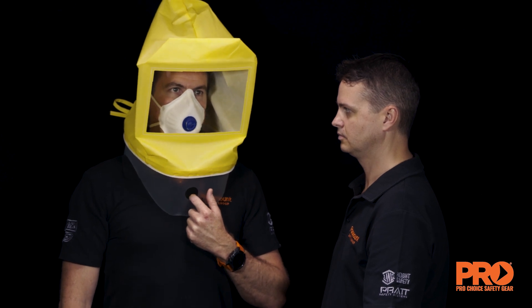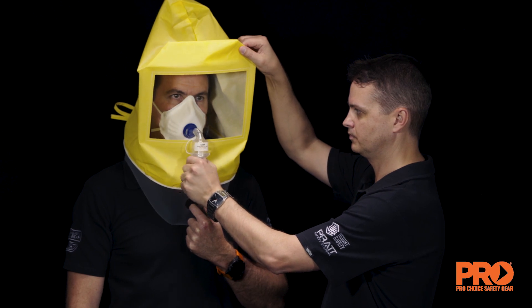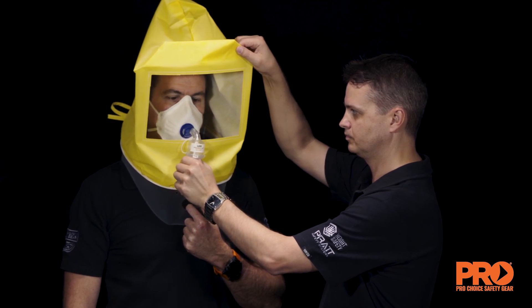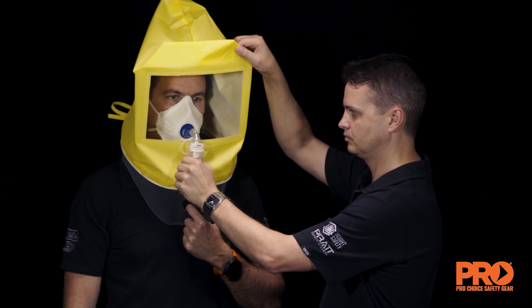A second failure may indicate that a different size or model respirator is needed. If the entire test is completed without the subject detecting the aerosol, the test is successful and respirator fit has been demonstrated.